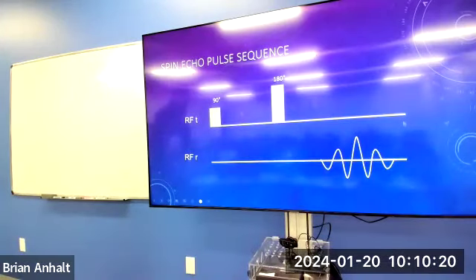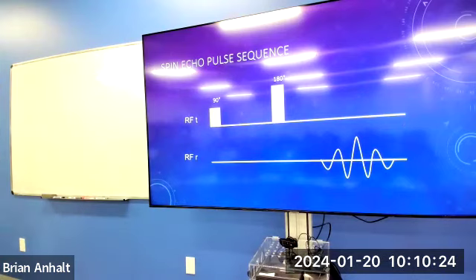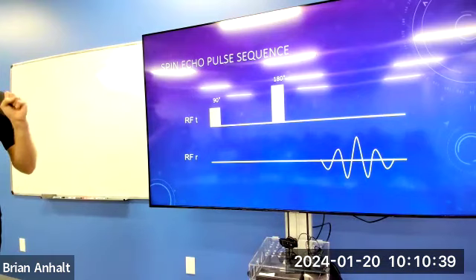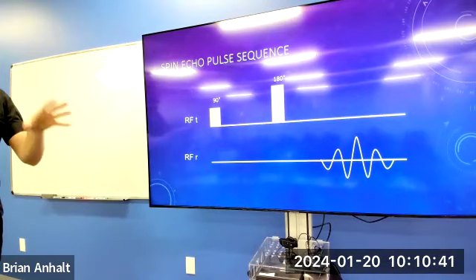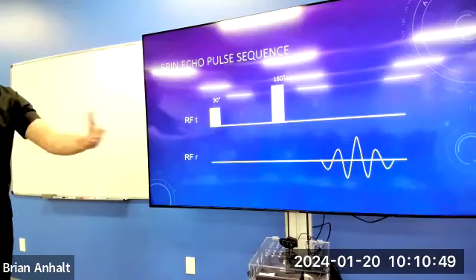A question: so flip angle is controlled by how much RF energy is put in, and the duration? Yep. So remember, we can do a 90-degree flip angle. We'll talk about other types of flip angles as well. The higher the flip angle, the more energy we have to transmit, or the more RF, or for a longer period of time. So it ultimately turns out to more RF, right? It's either a higher amplitude of energy or the same amplitude of energy for a longer period of time.